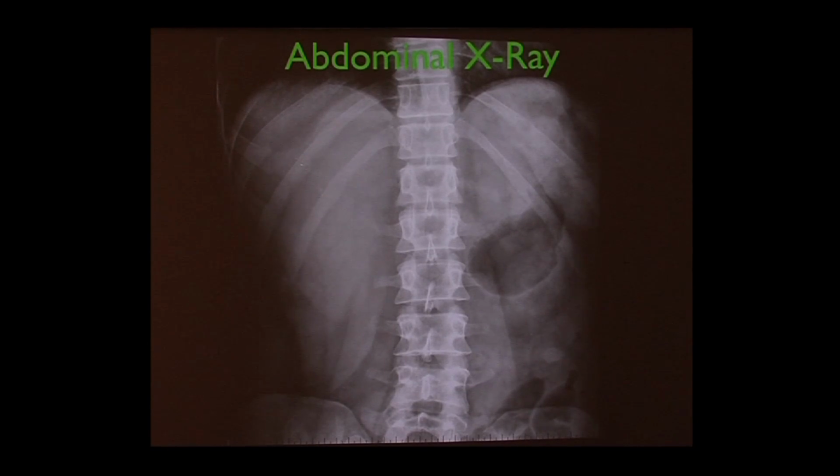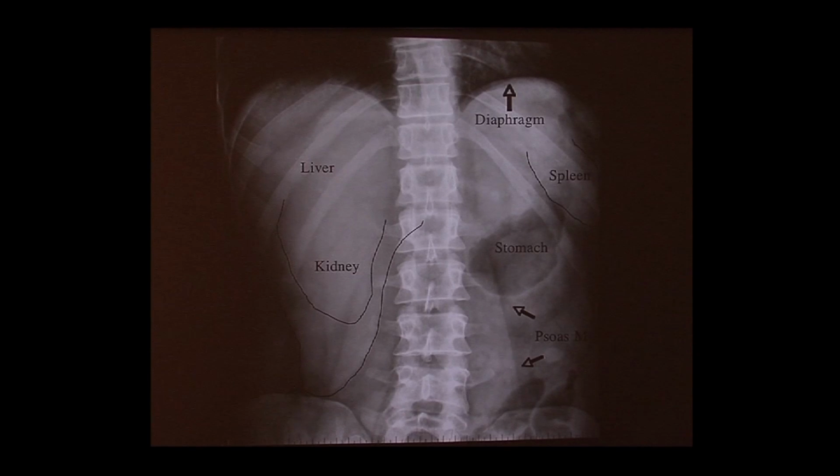It blocks more than air does. We can see outlines of structures because there's fat next to it. So for instance, there are the outlines of various organs. The medical detective, the radiologist, has to know what the anatomy is and be able to pick these things out from an image. And of course, if there's a kidney stone, it'll be whiter because it blocks more X-ray.